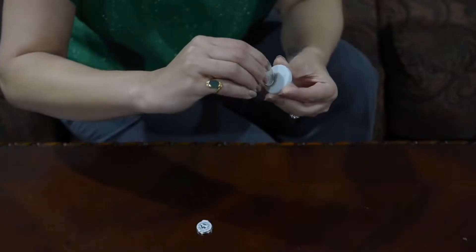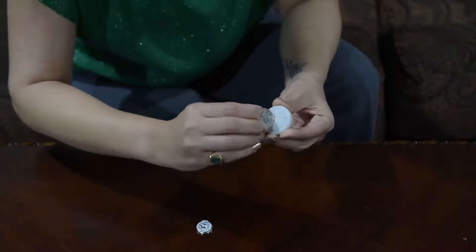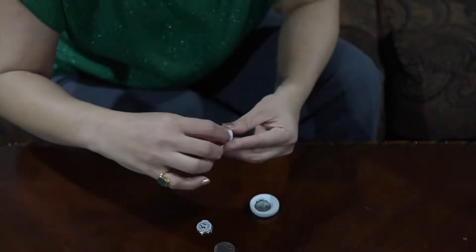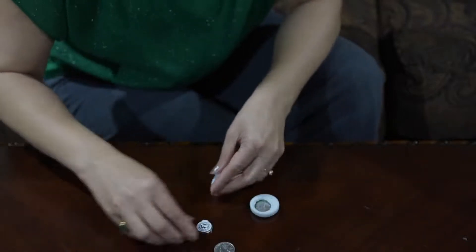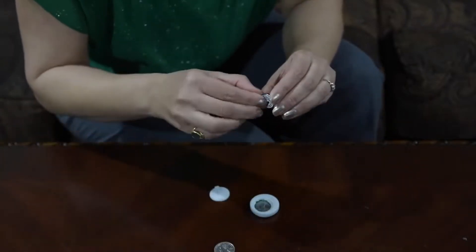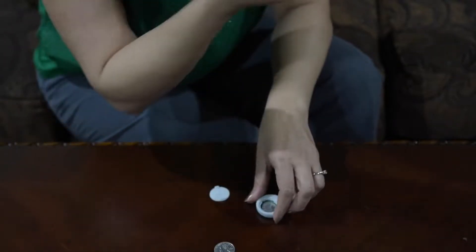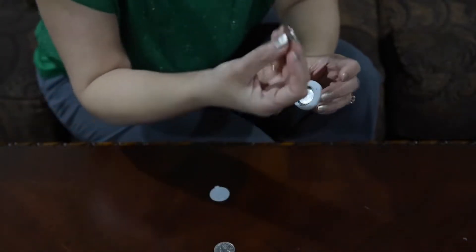Take a coin and rotate it anti-clockwise. Open the cover, take off the battery. Take the new battery, peel off the sticker, and make sure you are putting the positive side on the upper side.